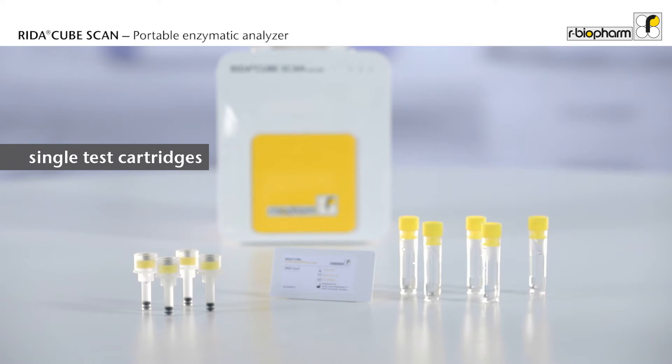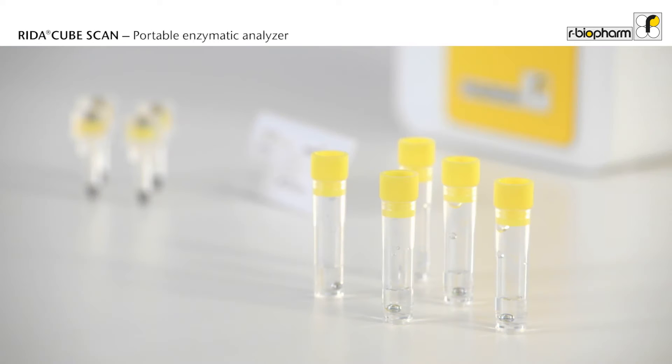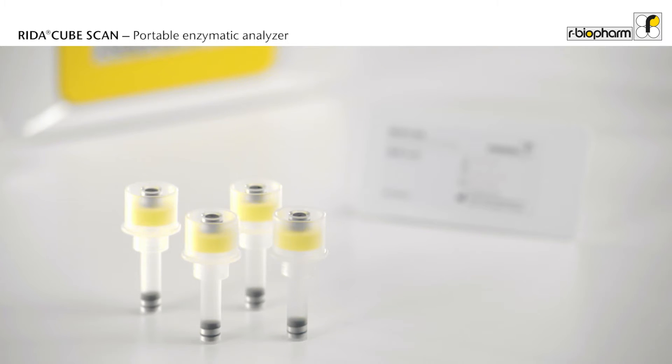The test kits contain 32 single test cartridges with ready-to-use reagents. Each tube contains buffer and a magnetic ball for mixing, and each cap contains the enzyme reagent for the specific reaction.